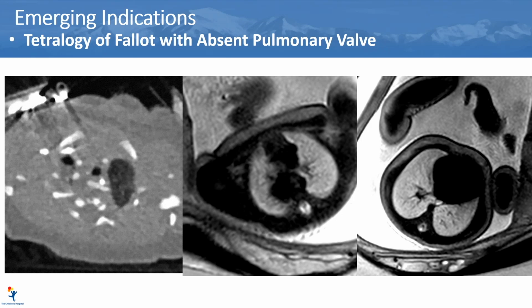The bronchi were severely compressed. This is hyperexpansion of the left upper lobe. There's a lot of airspace opacification in the right lower lobe, which is really probably fluid trapping at this point. And in the corresponding fetal MRI, you can see those areas of T2 hyperintensity in the left and right lower lobe that correspond to those areas of fluid trapping postnatally. You can also see it in the left upper lobe that was air trapped postnatally, and we could see massive pulmonary arteries. I haven't shown them on this, but you can also see severe bronchial obstruction, because we see the bronchi incredibly well in the fetal period since they're filled with fluid.